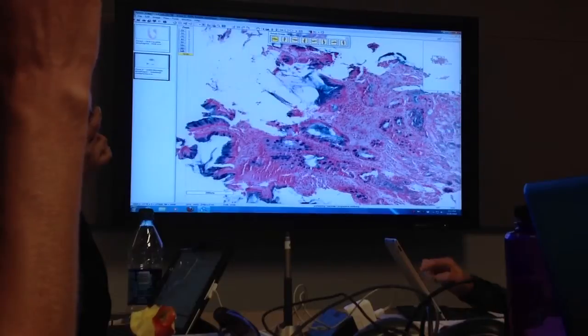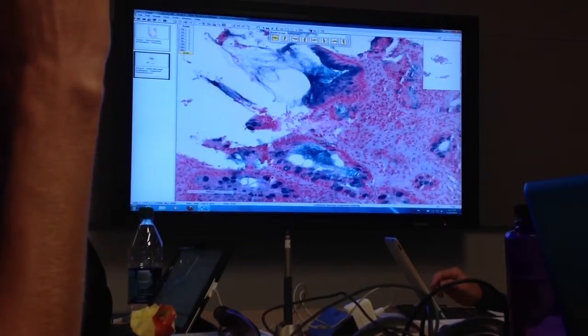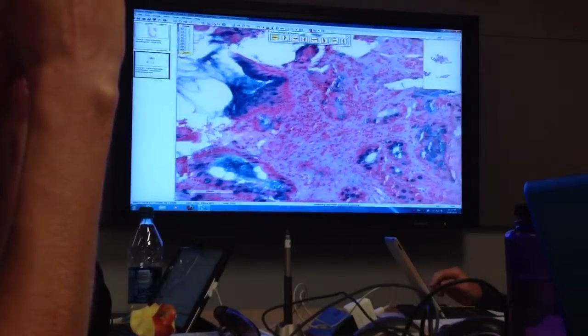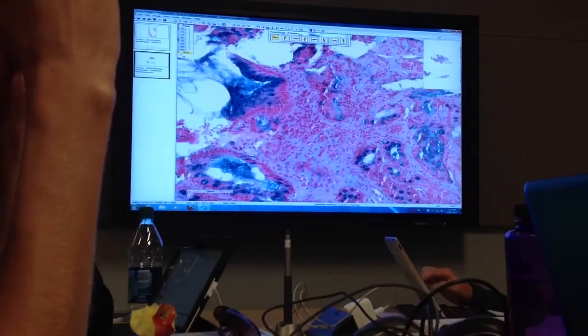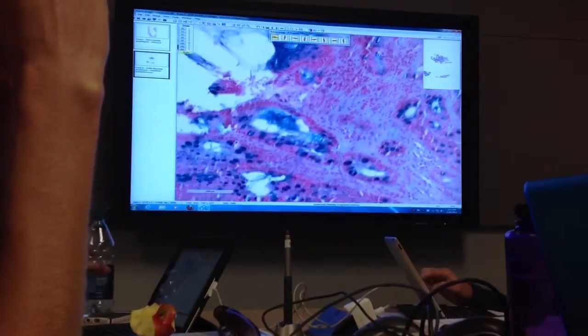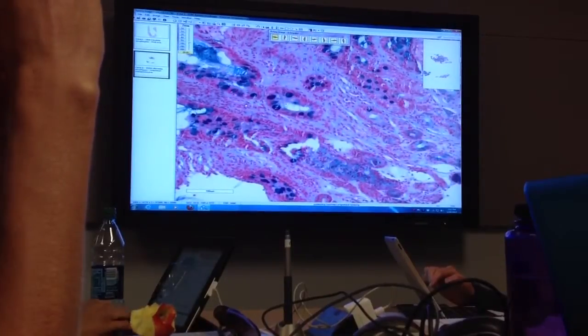We talked about the epithelium. In here, it's kind of hard to see, but see all these little red cells? Let's go to a higher power. Some of these are stromal cells, but some of them are not. Some of them are chronic inflammatory cells like lymphocytes. So this is what you see in reflux in this area. You'll see a lot of chronic inflammation. Sometimes you can see acute, but there's a lot of chronic inflammation in here.